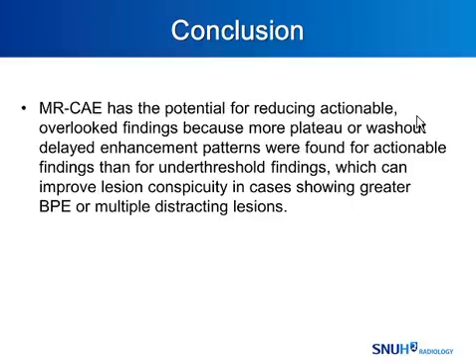In conclusion, MR-CAE has the potential for reducing actionable overlooked findings because more plateau or washout delayed enhancement patterns were found for actionable findings than for under-threshold findings, which can improve lesion conspicuity in cases showing greater BPE or having multiple distracting lesions.